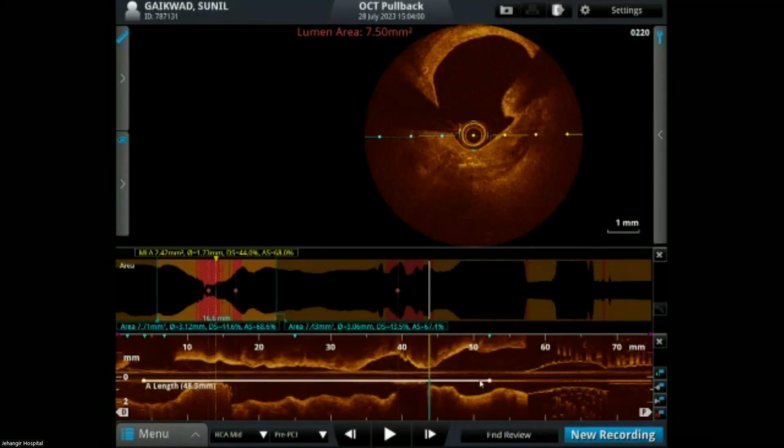Proximal reference diameter is around 4.4. Distal reference diameter is around 3.7. So seeing the calcium score is 4, and we know that in this kind of calcified coronary artery, we need a modification device. Now, Dr. Duggal will tell you what we did.